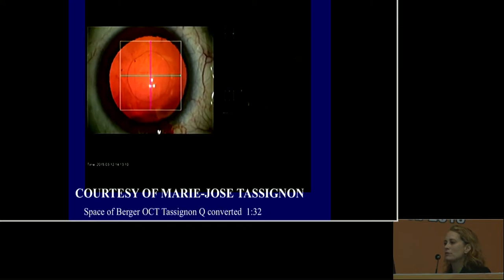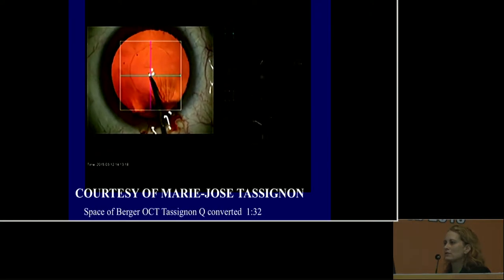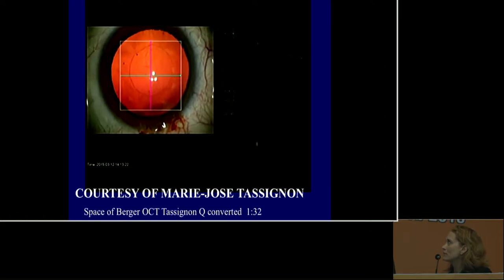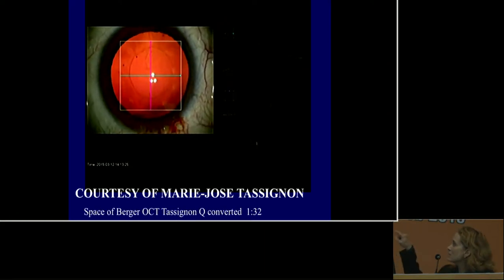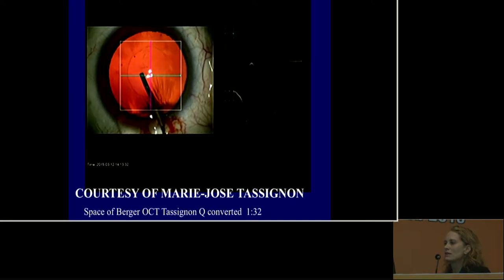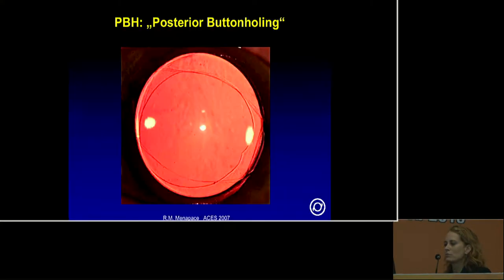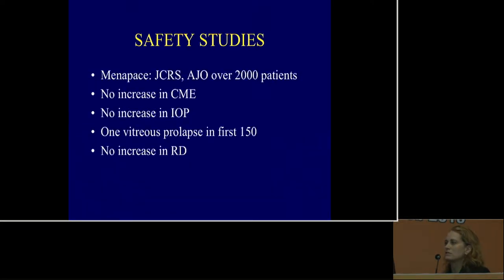This is courtesy of Dr. Marie-José Tassignon. Using intraoperative OCT, you can see what happens when you do a primary posterior capsulotomy — she introduces a 30-gauge needle bevel up, which pierces the posterior capsule while staying away from the anterior hyaloid. A little bubble prolapes through that defect, but if you go in with cohesive viscoelastic, you can push it back and create a nice space for a safe posterior capsulorhexis. This technique has shown very clear visual axis, with over 2,000 patients showing no increase in CME, no increase in IOP, only one vitreous prolapse in the first 150 cases, and no increase in retinal detachment.